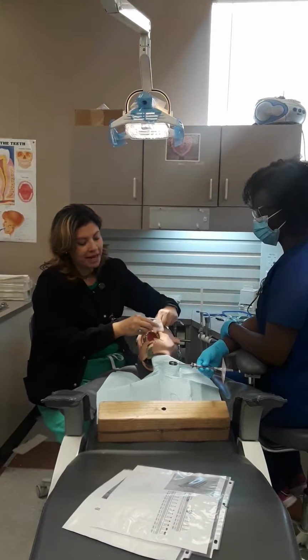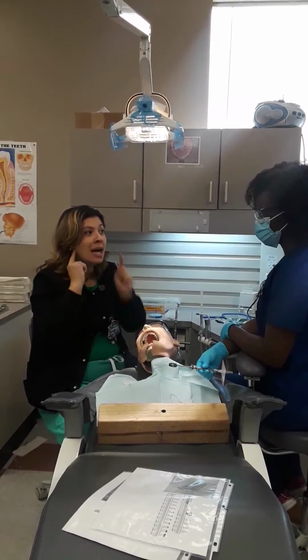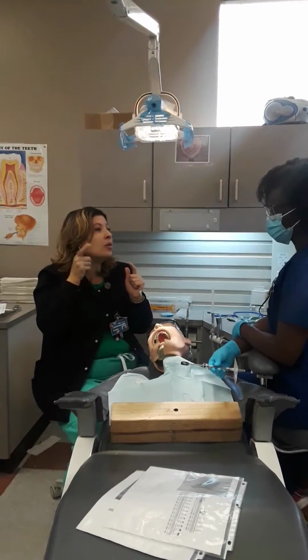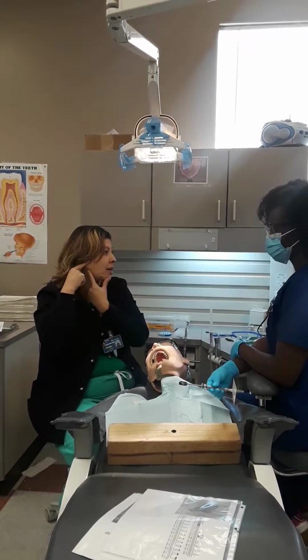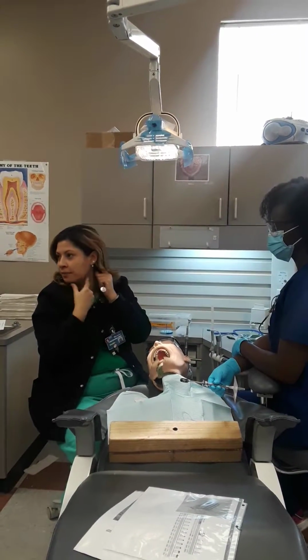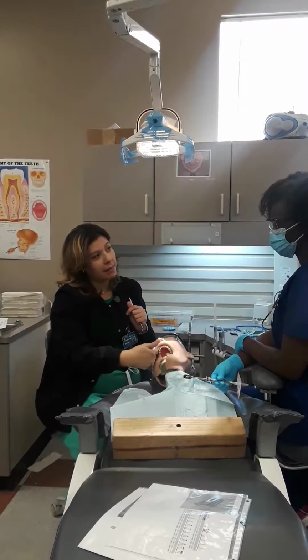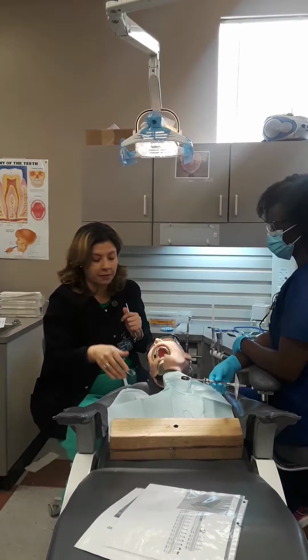So if I'm working on a maxillary, I'm going to wipe right above the tooth. If I'm working on the mandible, I'm going to do it in the corner, because the whole block, or the whole jaw for the mandible, gets numbed. So the whole corner of the jaw will numb the whole left or right side, depending on where I'm working. On the maxillary, if I'm working on 6, I'm going to numb 6. It's just different for the top than it is the bottom.